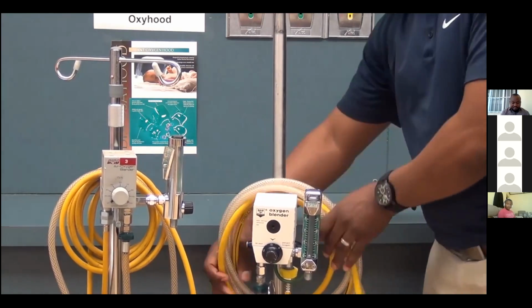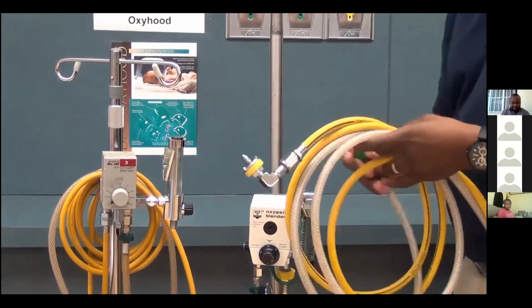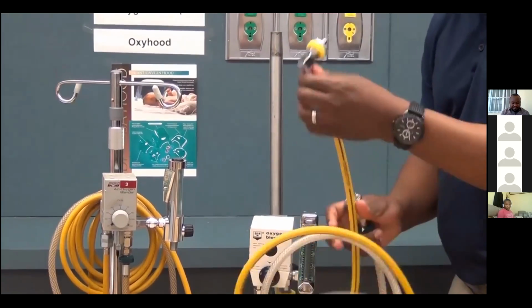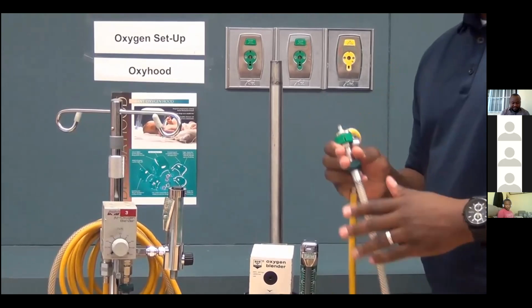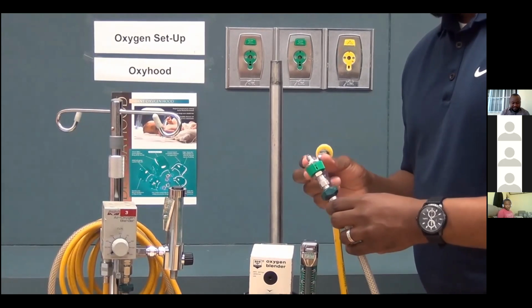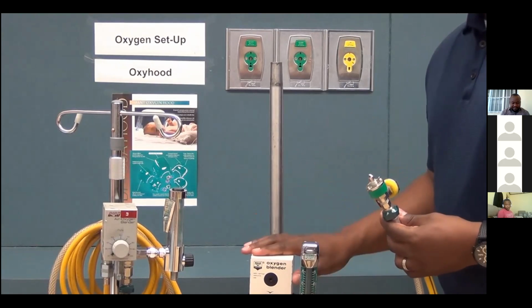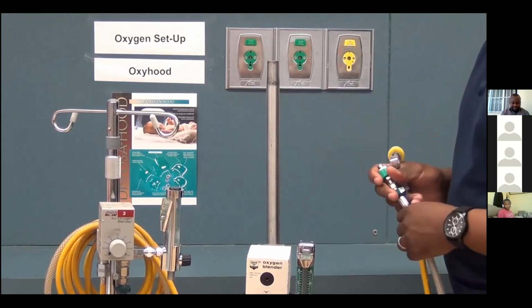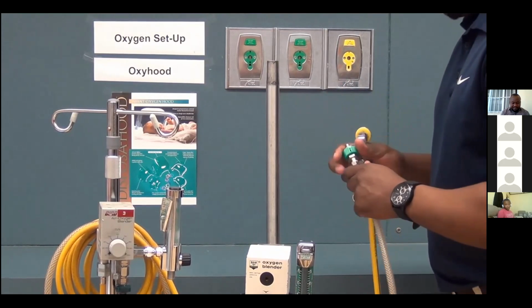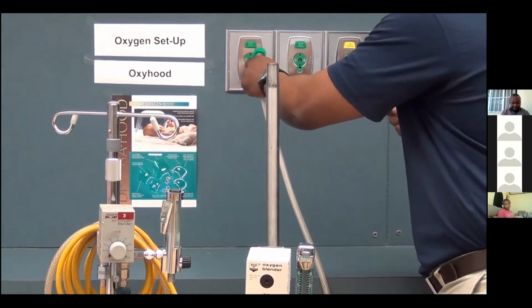To use the blender, you have to plug in the cables. We have oxygen and air. We plug them into the wall, and you'll notice that when I plug in one gas source, you're going to hear a high-pitched sound. That is an internal alarm for the blender to let the clinician know that either a hose is disconnected or the tanks or gas source needs to be changed.